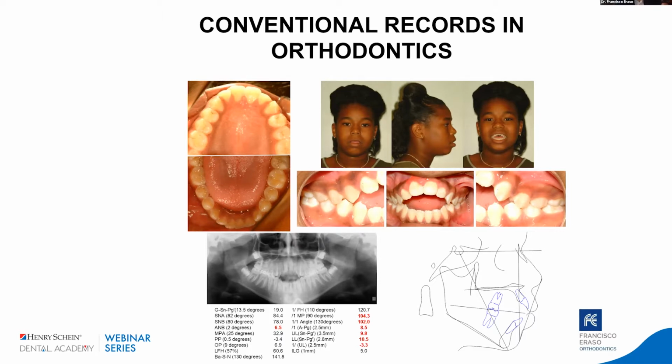But when you subtract and squeeze as much information as you can from the DICOM and from the digital pictures, you're going to have information that is extremely useful for your diagnosis and treatment plan, especially in orthodontics. Of course, implants, TMJ, airways and a lot of other things. But in orthodontics, we have the ability to manipulate a lot of things from an early age in our patients to all patients.